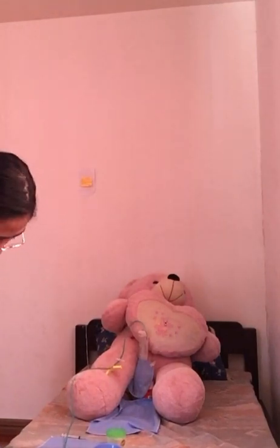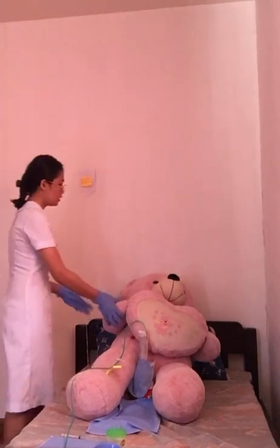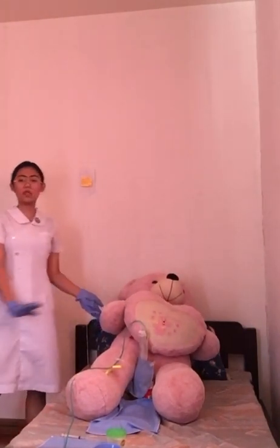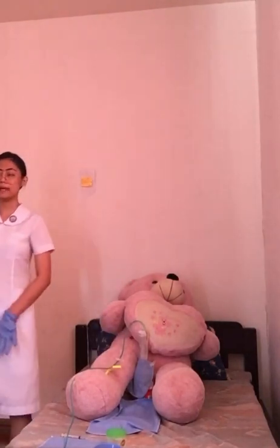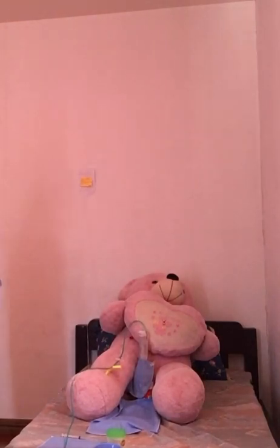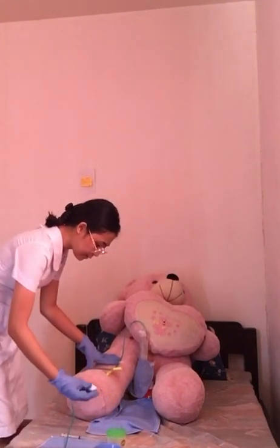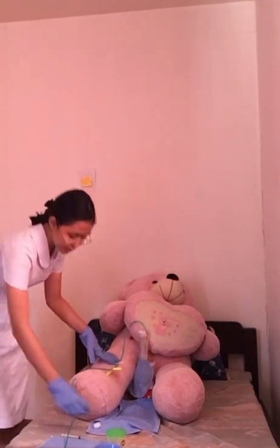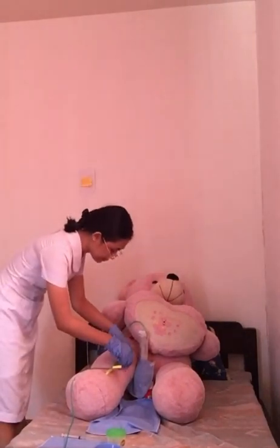And after that, we will assist the patient to a comfortable position, which is the supine position, and then place a waterproof pad under the patient's thigh. Also, we need to remove the catheter from the device or the tape anchoring the catheter, and use an alcohol swab.